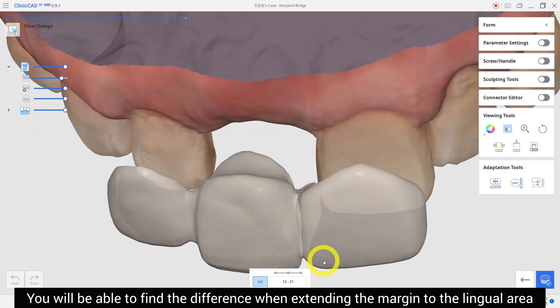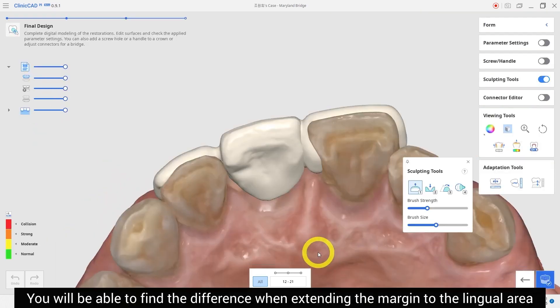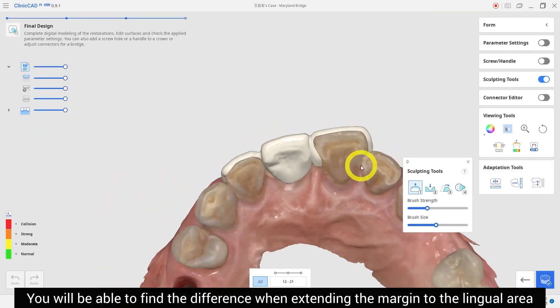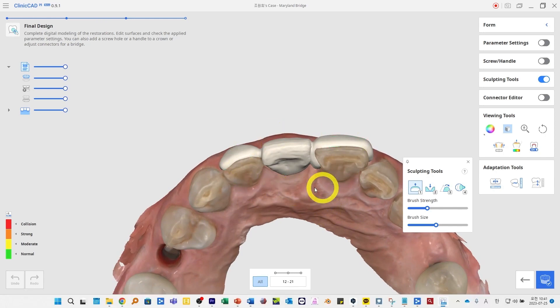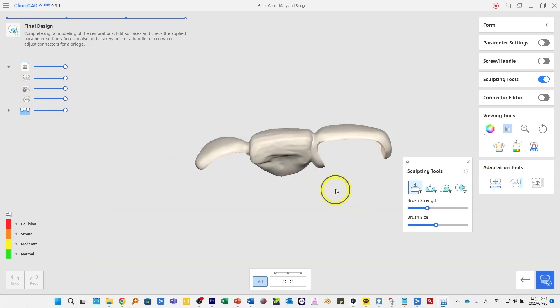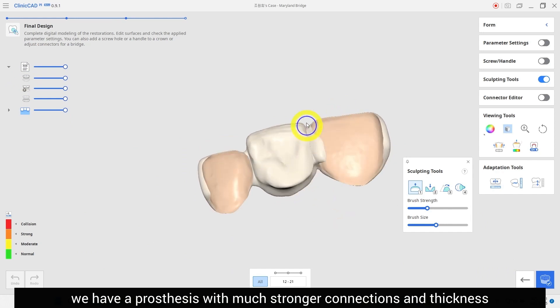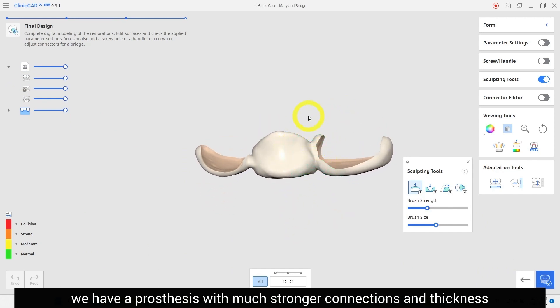You will be able to find the difference when extending the margin to the lingual area. Compared to the previous result, we now have a prosthesis with much stronger connections and thickness.